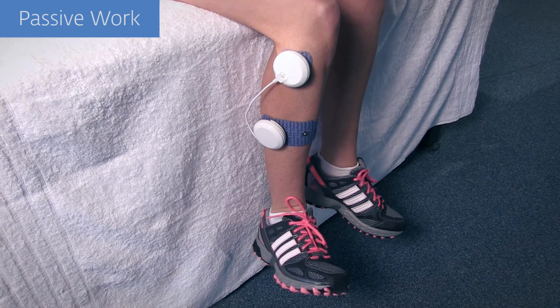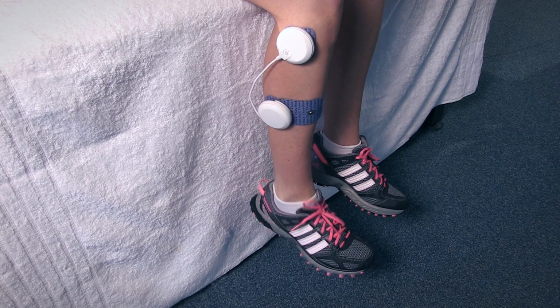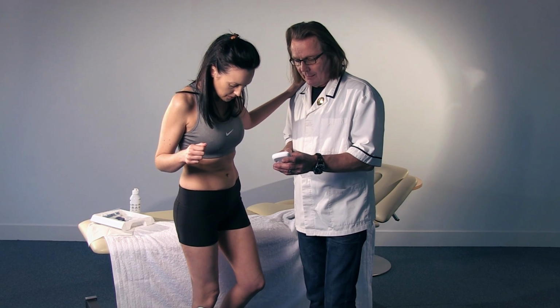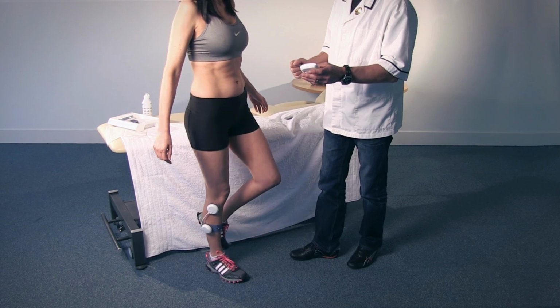Muscle work can be started in non-weight bearing, and if desired, eccentric work on the peroneals, everters, can be induced by actively recruiting the foot's inverters.